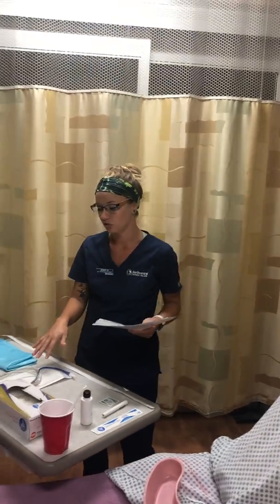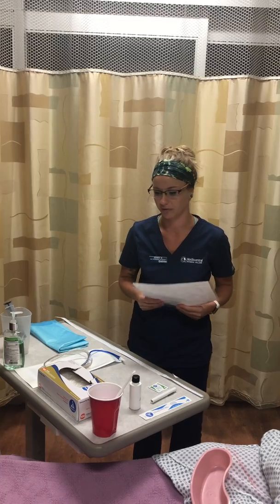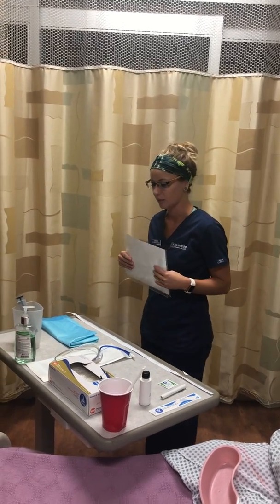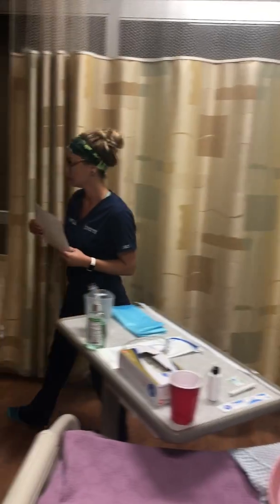Another thing with the NG tube is you might need a stylet in place for insertion, but in this case I do not need it for my procedure. And now that I have all of my supplies ready, I'm going to go ahead and enter my patient's room.